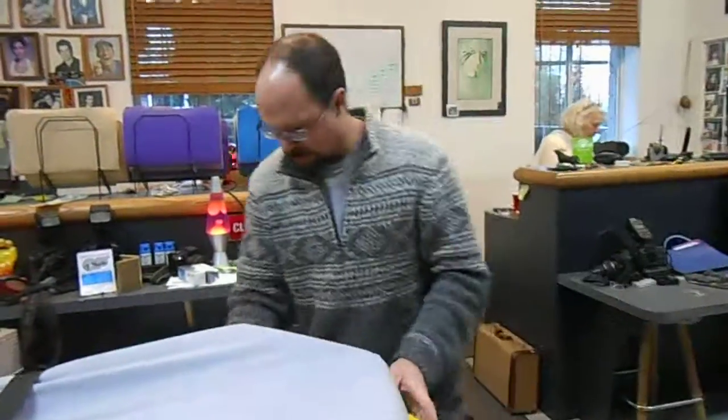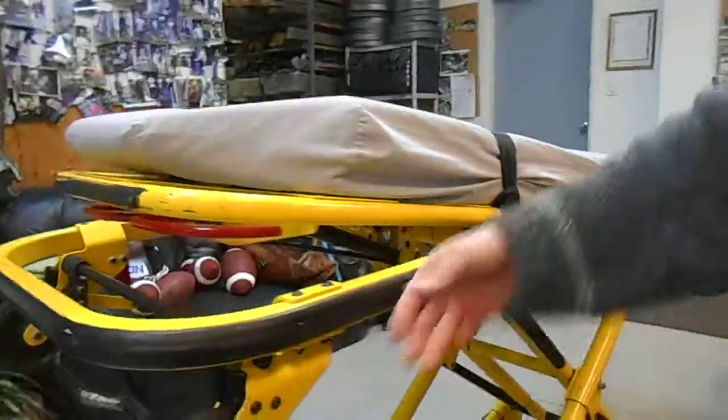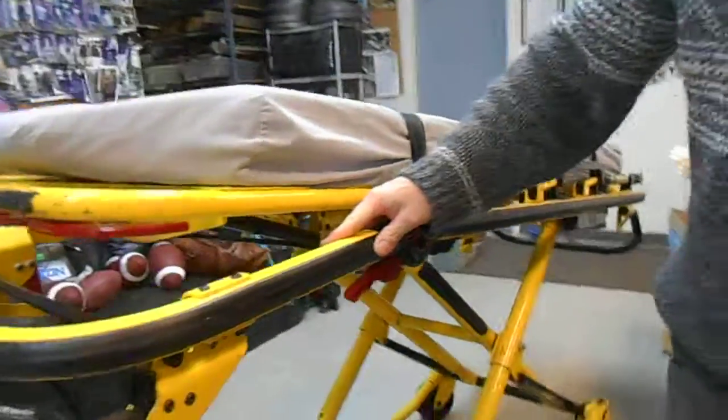And last, there is a handle over here to raise and lower the back piece. Make sure that the back piece is up, or else when you lower the gurney it will hit the floor. And that is the handle.